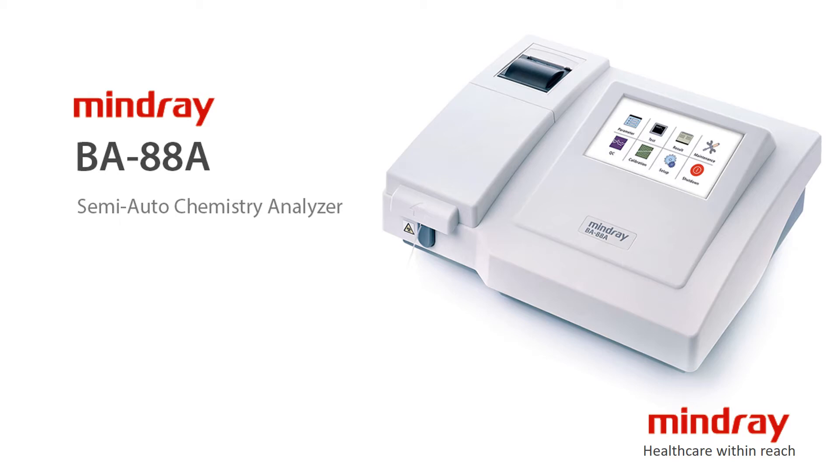Mindray B88A is a semi-automatic chemistry analyzer with a large touchscreen and easy-to-use operation software.